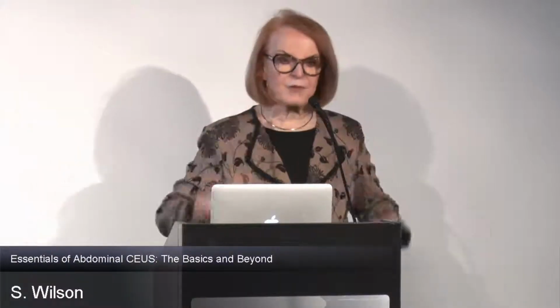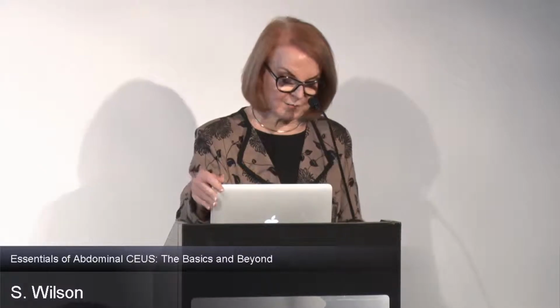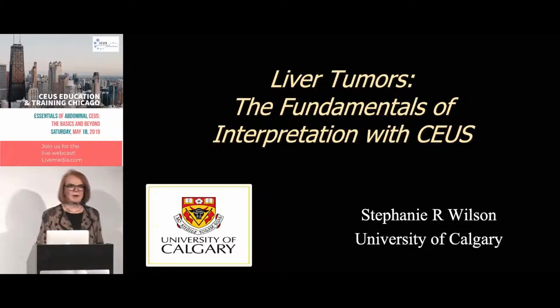So the presentation that I'm going to make right here, I've entitled Liver Tumors, the Fundamentals of Interpretation with CEUS. Obviously I've been doing this for a long, long time. A few years back, it struck me that although there are lots of rules and lots of exceptions and lots of important little things you need to know, in actual fact, there are some fundamental things that are so important, and if we know those, that really helps us to keep going.